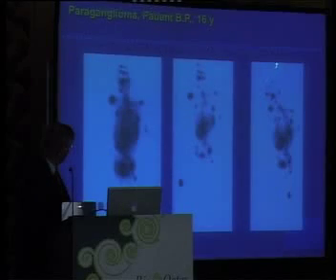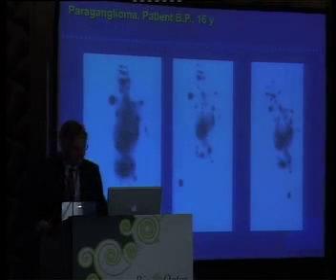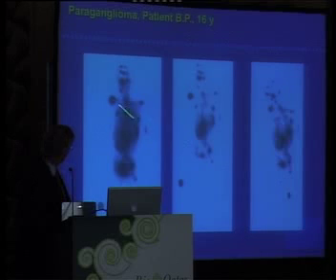So he was referred to Bad Berka in Germany for treatment. You see here his somatostatin scan, 50 minutes, 1 day, 6 days after injection, and you see those many, many tumors. All the black dots indicate the presence of metastases. Here also in the skull, this is the standard, it's outside the body. And here is a big tumor in the adrenal.